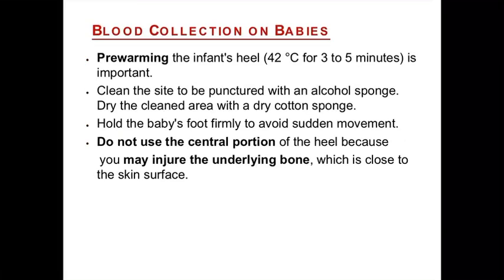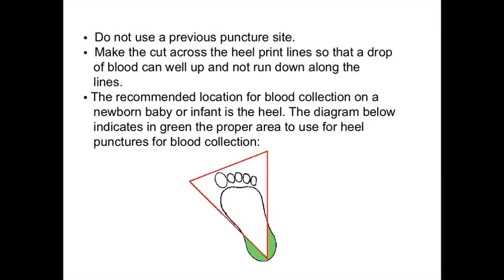Do not use the central portion of the heel because it may injure the underlying bone, which is close to the skin surface. Do not use a previously punctured site. Make a cut across the heel print lines so that a drop of blood can well up and not run down along the lines.